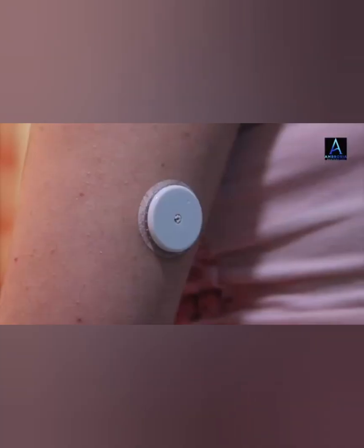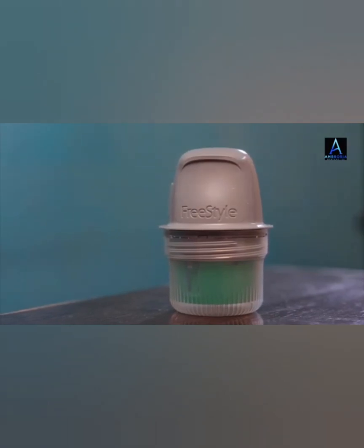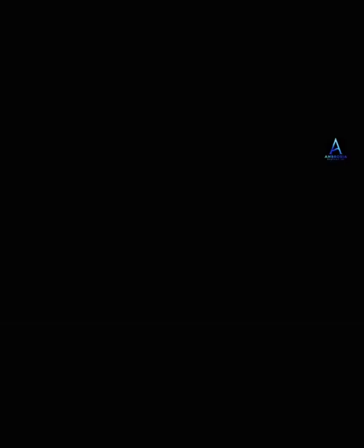Place the sensor applicator over the prepared site and push down firmly to apply the sensor to the body. Gently pull the sensor applicator away from the body. The sensor should now be attached to the skin. Make sure that the sensor is secure after application. Put the cap back on the sensor applicator and discard the used sensor pack and sensor applicator according to the procedures.